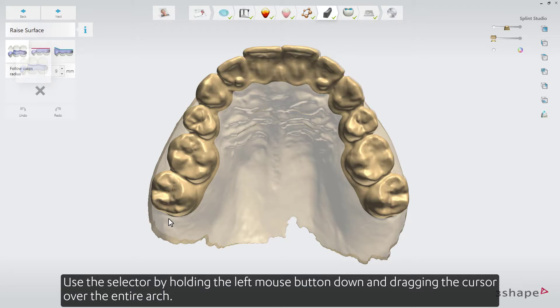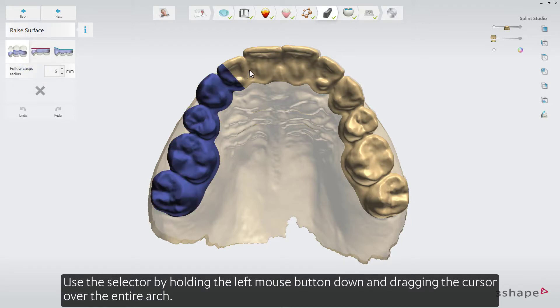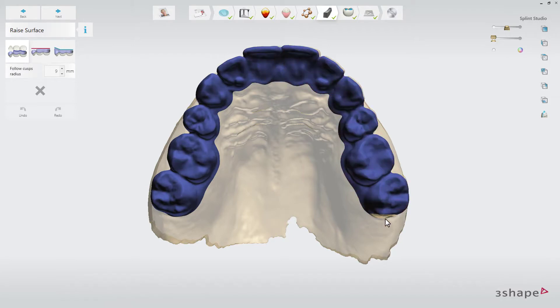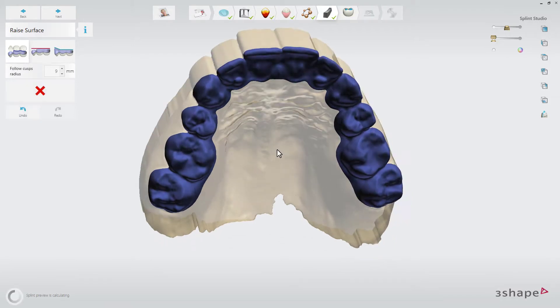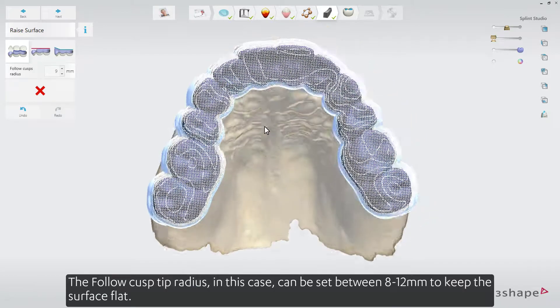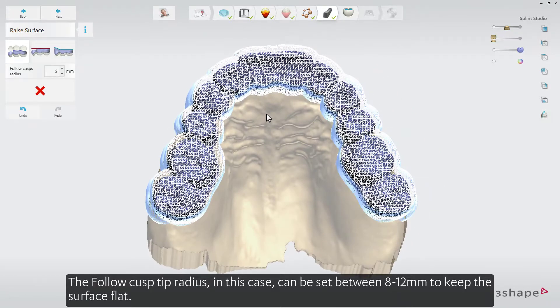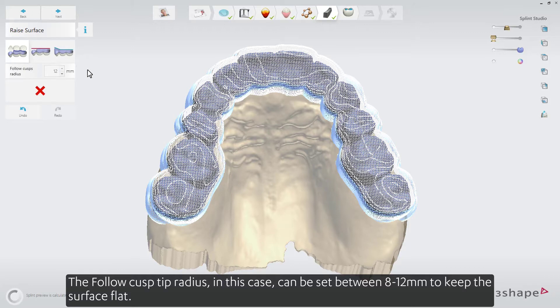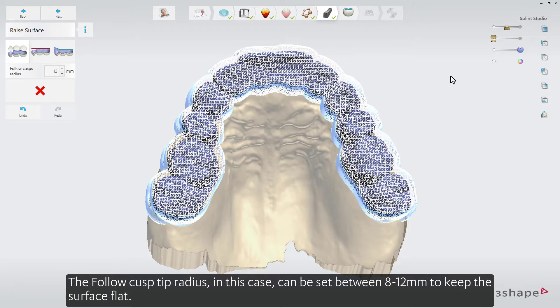Use the selector by holding the left mouse button down and dragging the cursor over the entire arch. The Follow Cusp Tip radius, in this case, can be set between 8 to 12 mm to keep the surface flat.